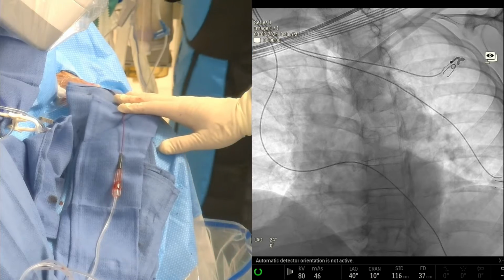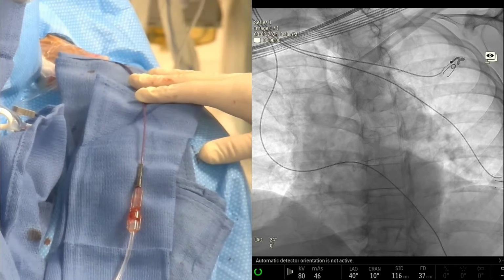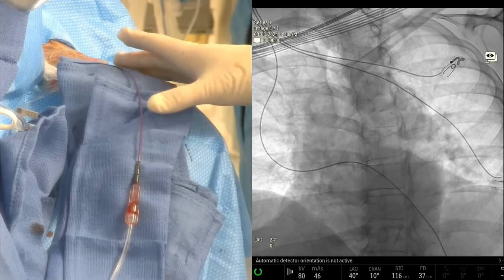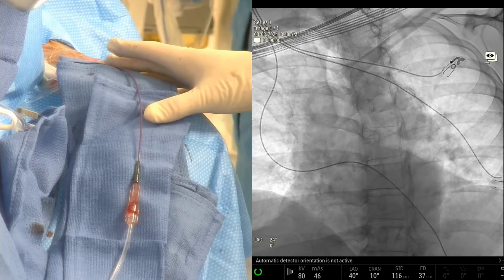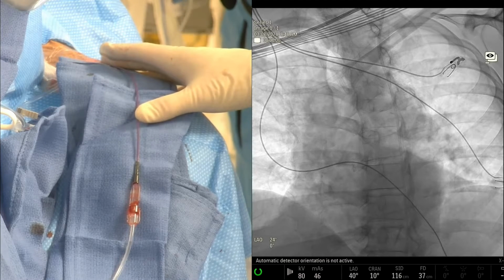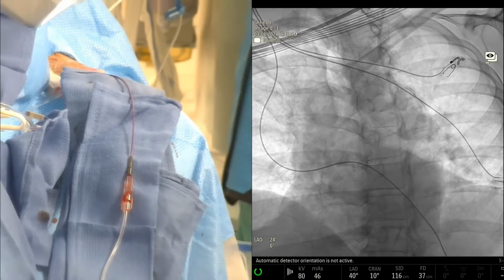This diagnostic catheter that we have in here is a 130 centimeter Penumbra Berenstein tip. It's a nice catheter, 040 lumen. What I like about this for radial access is it's 130 centimeters, so this gives us a few extra centimeters to get to the target vessel. We're hooked up to the power injector right now, but we haven't done the angio yet.